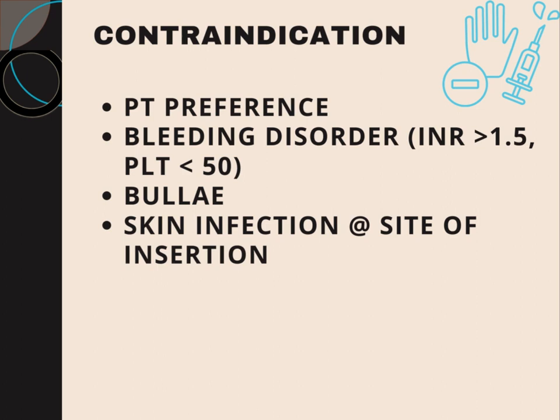At the point of insertion, you need to be very well aware of skin infections. You need to inspect the site of insertion, the safety triangle, and if there is skin infection there, you need to avoid that specific area. So these are simple things to keep in mind before doing the procedure.